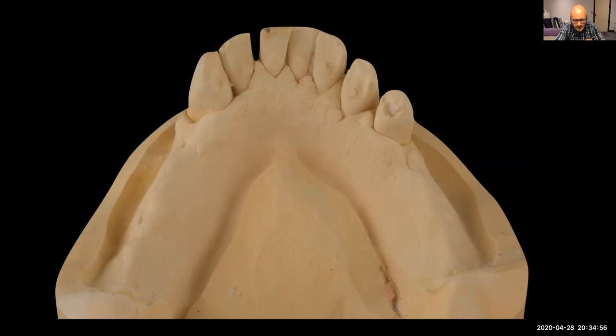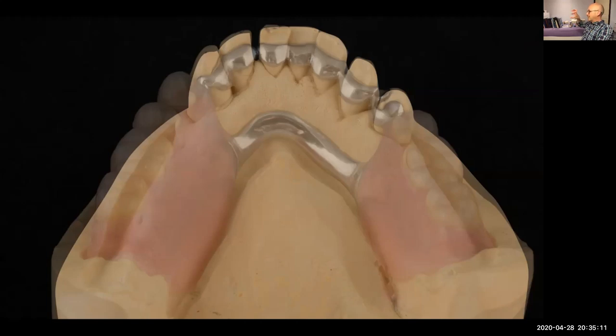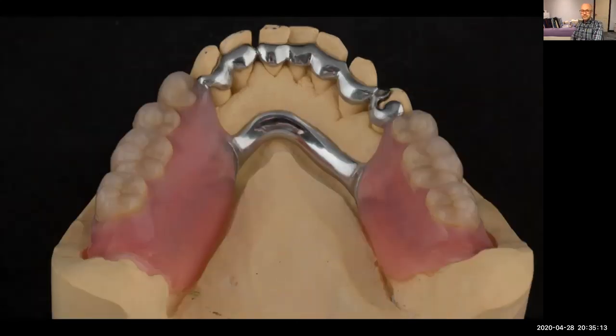But these composite rest seats are fabulous. They're truly brilliant. You can see this is his model here. They just go on the back of the teeth there, and these act like little rest seats for holding the denture to stop it from going backwards and down, touching lots of surfaces of the teeth. And these are really so good. You can press on these saddles and the denture just doesn't move.